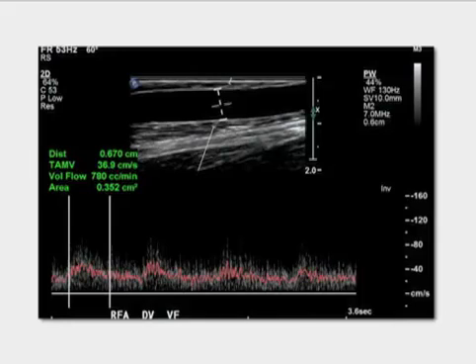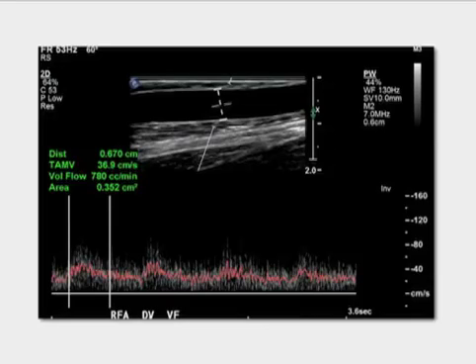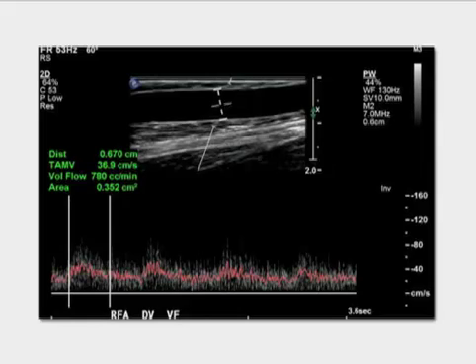The second potential killer application for 3D imaging is volume flow. In many areas of ultrasound imaging, on a daily basis, we try to estimate volume flow through vessels — in this case, a dialysis access graft. We do that by looking at the cross-sectional area and multiplying that by the velocity to get an estimate of volume flow. But it's only an estimate and is subject to errors.